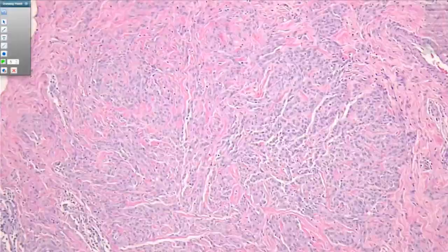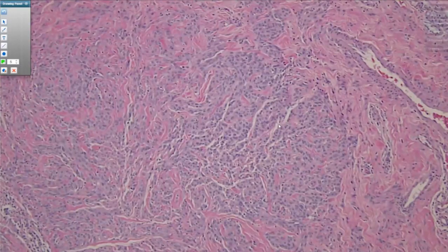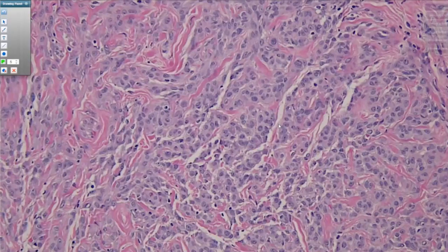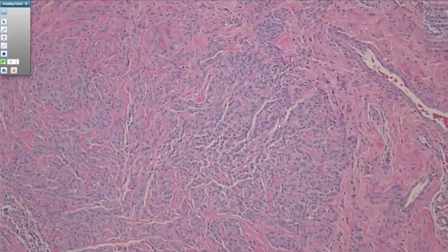Immunohistochemically, as I mentioned, myofibroblastomas of the breast label for CD34, as well as ER, and we'll talk about how that could be a potential pitfall in a minute. The myofibroblastomas can also label for desmin and BCL2. Important pertinent negatives are that they're negative for S100 and negative for cytokeratin. So let's take a look at a few other examples that aren't so histologically classic in appearance.